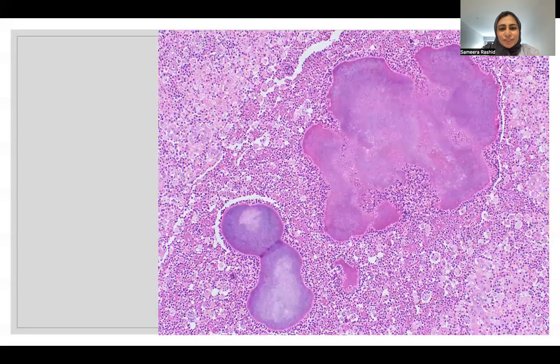On the permanent section, you have the diagnosis. So this is a lesion that we see not just in the tubal ovarian abscess, but more commonly in the tonsils. And also we see them in the neck cervical lymph nodes. These are sulfur granules and some radiating filaments, and surrounding this area I have macrophages, acute inflammation, chronic inflammation. So this is tubal ovarian abscess associated with actinomyces.